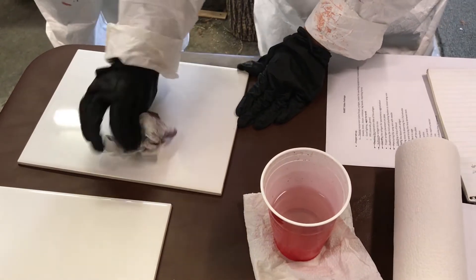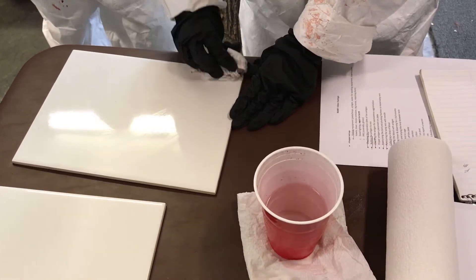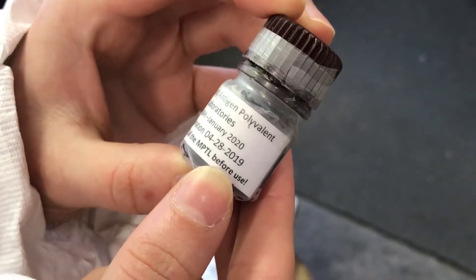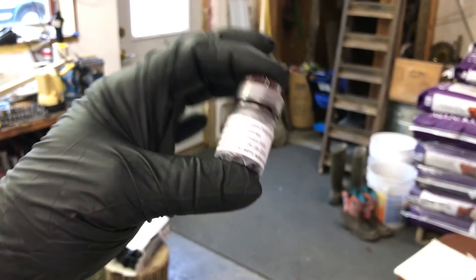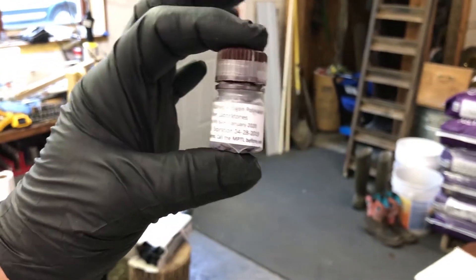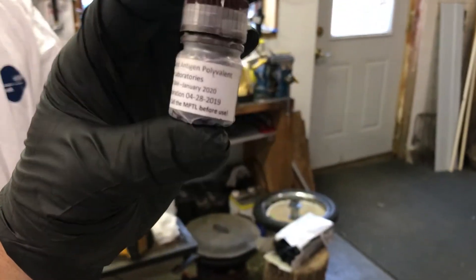Before you begin, you should double check that the antigen has been stored properly in the refrigerator. Check the expiration date to make sure the antigen is not expired. The antigen should come to room temperature before testing. Roll the antigen in your hands to mix.